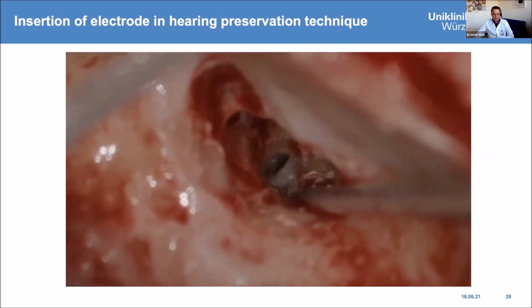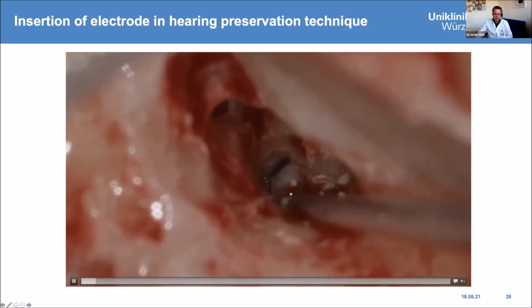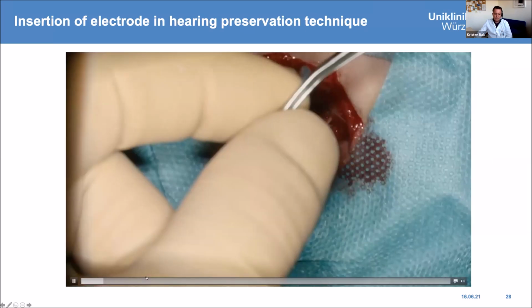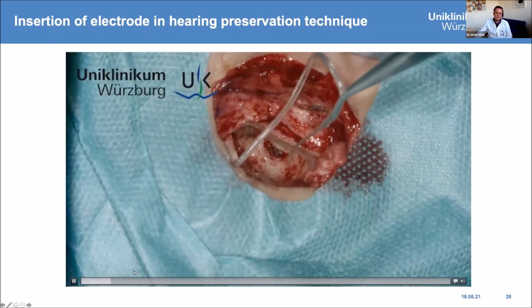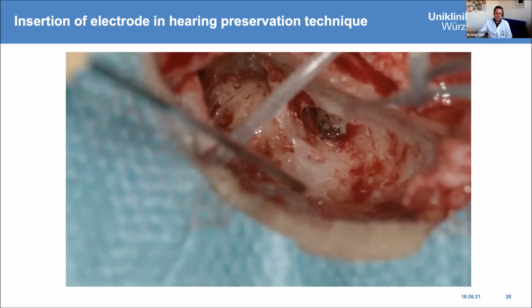and here you can see that we really gently open the round window in this patient. I hope the video is well seen. And then I always try to insert the electrode really slowly. I try to take at least 2 minutes of time.